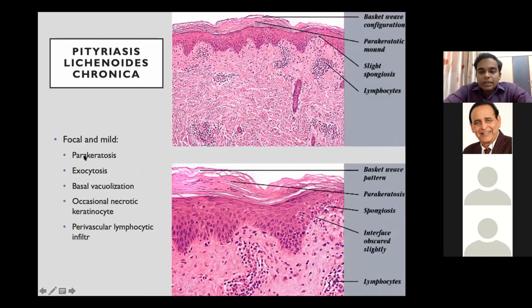Then there are other disorders in which you are able to see lesions clinically, but histopathology is generally very disappointing. You don't get specific reports. It doesn't help many a times. So pityriasis lichenoides chronica is one such situation where you'll have some sprinkling of lymphocytes in the papillary dermis. Some of them may be entering the epidermis, and then some have a non-specific perivascular inflammation. That amount of aggregate and this sort of pattern is very non-specific. It can be seen in anything: PMLE, drug reactions, any edema, any spongiotic dermatitis also.